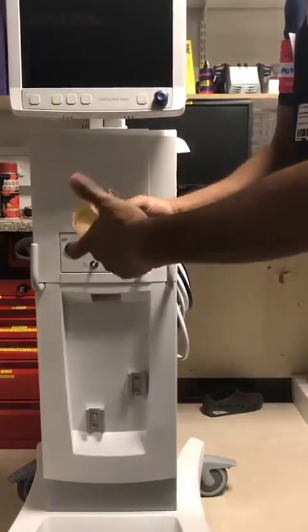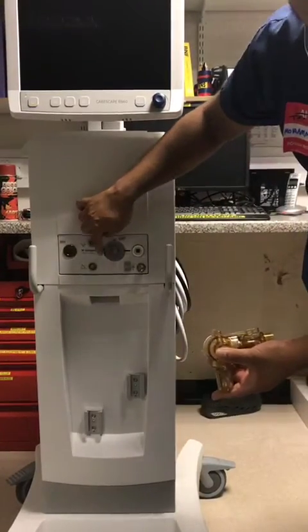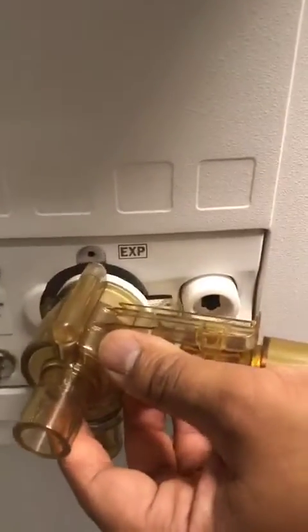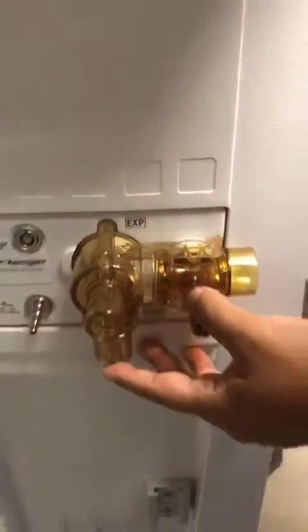With the valve, it's got a groove over here, so it goes into the pocket here. What you do is angle it, then feed it in and it will click in like so.